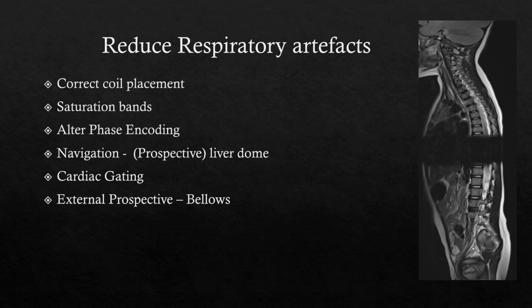This can be inefficient if your patient is quite unwell and has an inefficient heartbeat and cardiac cycle. And the gating methods are inefficient because only the data collected in specific parts of the cycle can be used, so it can result in a really long scan time and really long TRs.